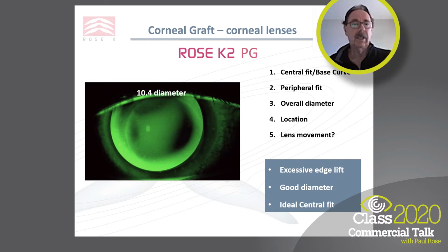The patient was happy. But one thing it did teach me is that in grafts, you are better to have excessive edge lift than a closed edge lift. That will cause you much, much more problem than an open edge lift like you see here. So in this case, if I was going to make a change, I would simply have ordered a decreased edge lift.